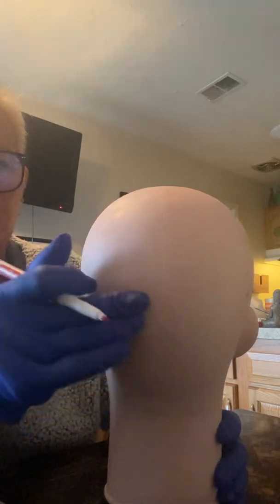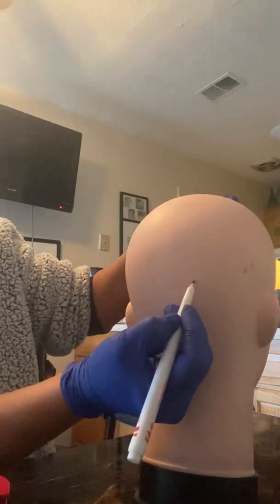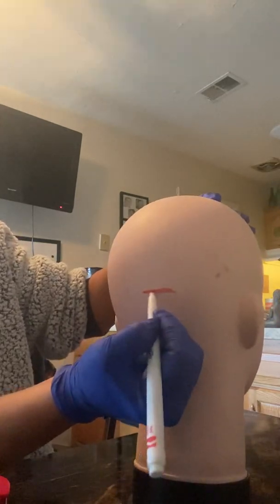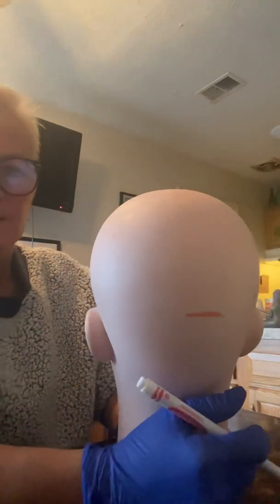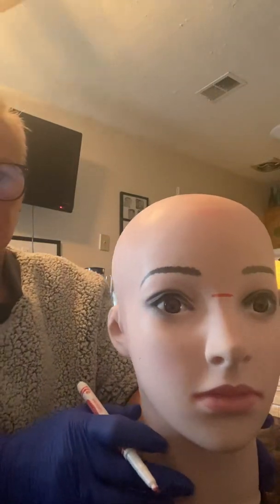There is a bone in the back of the head, the occipital bone, and just below that occipital bone is usually a little indentation. I'm going to mark right about here. It's a dummy so it's not going to be as protruding as a real head would be, but we'll do the best we can. So we have a nasion and an inion, and now we're going to mark the two preauricular points.